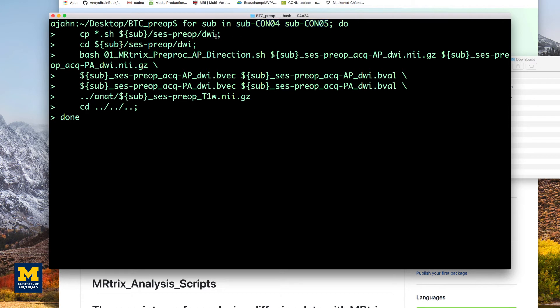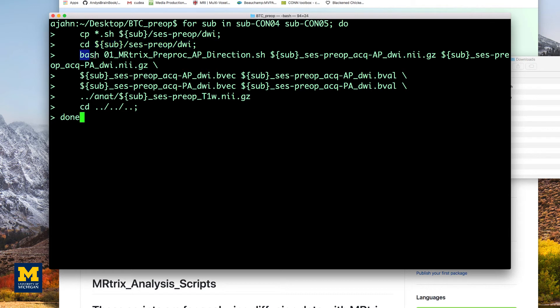The loop will copy the scripts into each subject's DWI directory, navigate to the directory, and run the code that we just saw.